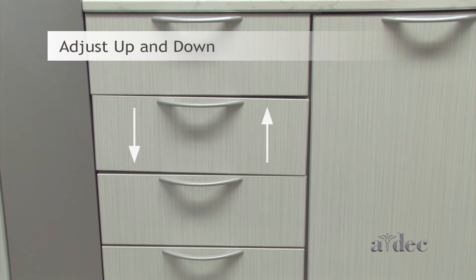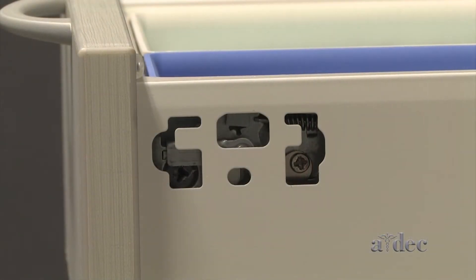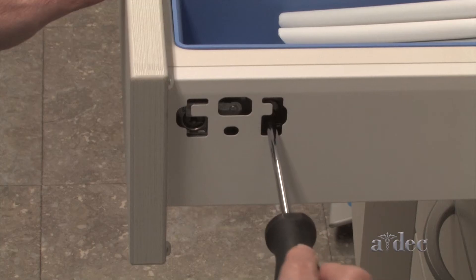To adjust the drawer face up and down, use the cam screw to adjust each side.